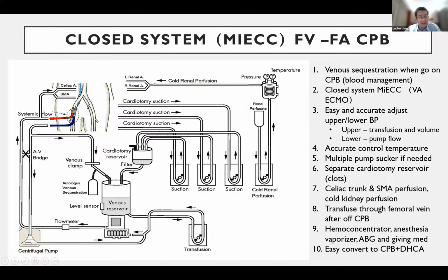So this is like a MEC system. Actually, it's like a VA ECMO. So it's a closed system. At the same time, any blood in the surgical field, you can still use a pump sucker to collect in the reservoir, and you can still use this transfusion pump to transfuse back to the patient.